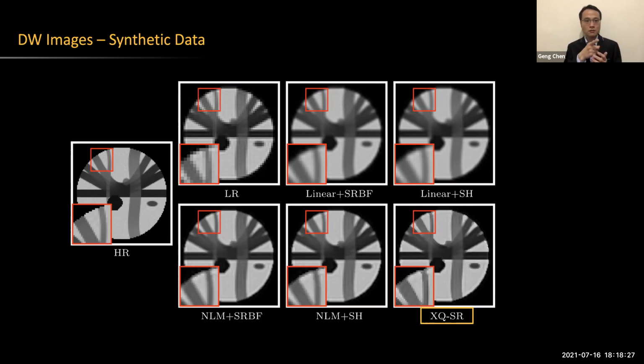I remember for the denoising work in the paper, we have a set of results for some different fiber bundles. Using our method to denoise the data, based on the denoised data we can reconstruct rich fibers, more fibers, and the fibers are also clean. This matches what we expect for the tractography, so it can improve the reliability of tractography results. Cool. Thank you.